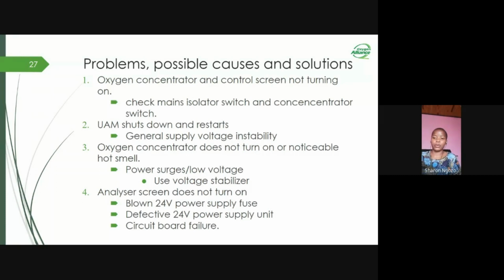The other problem we'll look at is where you have the analyzer screen not turning on. This will be caused by a blown 24 volts power supply unit fuse, or if you have a defective 24 volts power supply unit. Even when the circuit board is failing, it can cause the analyzer not to turn on. So all you have to do is check them out. If they need to be replaced, make sure that you replace them.